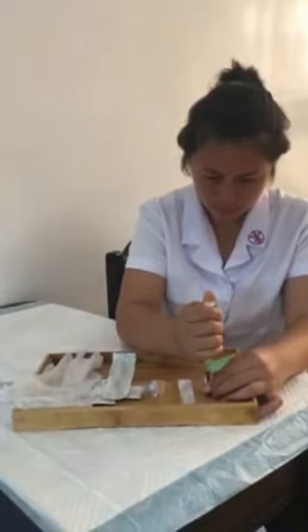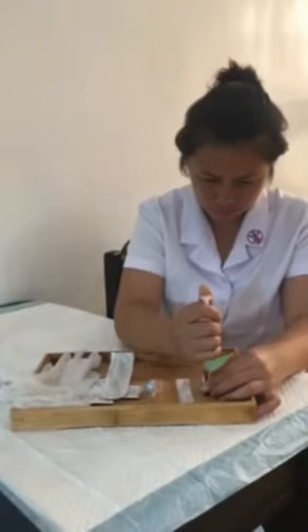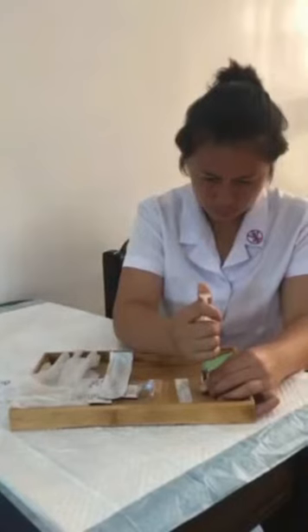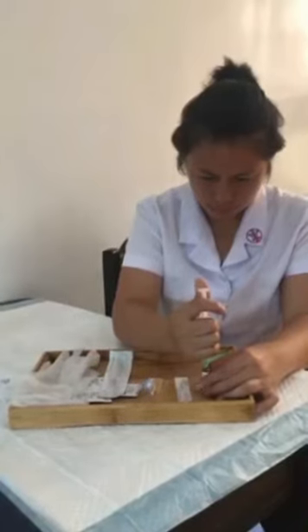Remove the cap from the filter needle and insert the needle into the center of the ampule. Do not touch the rim of the ampule with the needle tip or shaft. This will keep the needle sterile. Withdraw the amount of drug required for the dosage.